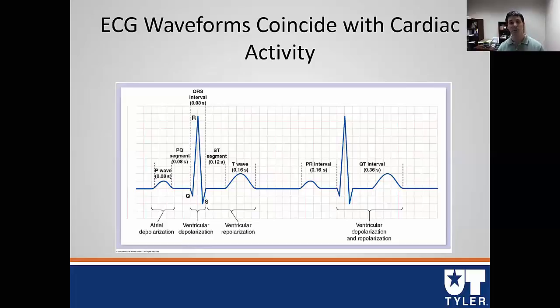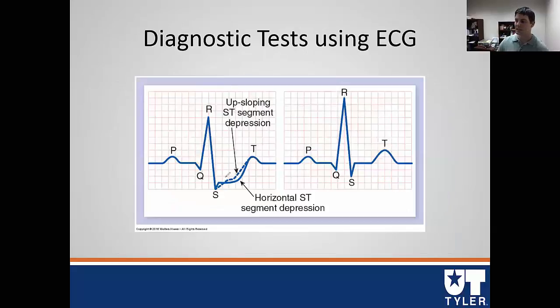So what we can do is put them on a treadmill, do what's known as an exercise stress test, where they go to a pretty intense effort and we look at an ECG, because, as we mentioned earlier, the coronary arteries, if they have any type of blockage in them, will actually have an effect on this ECG. And indeed, this is what we see in this next figure.